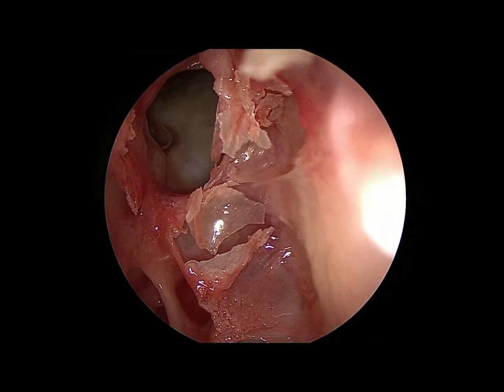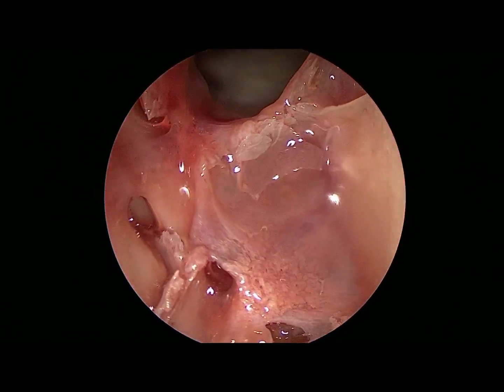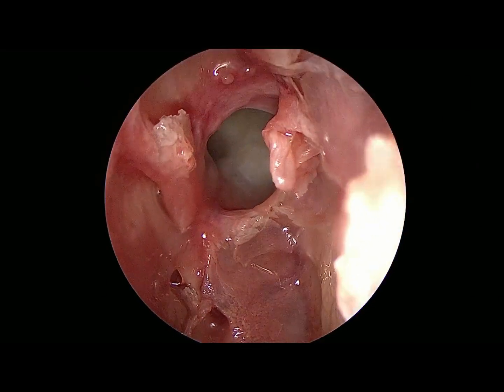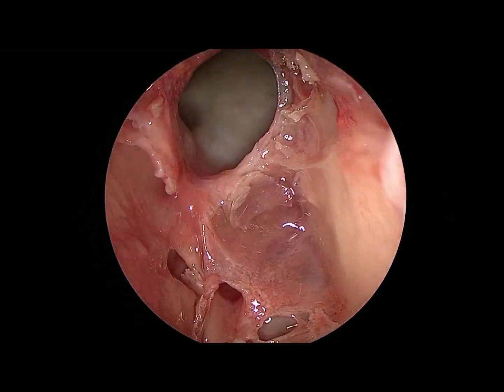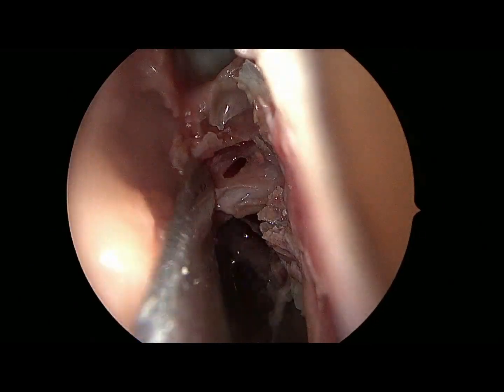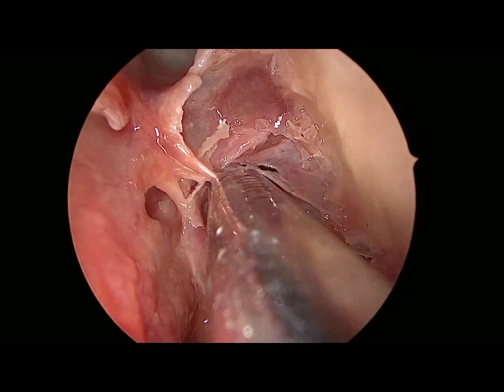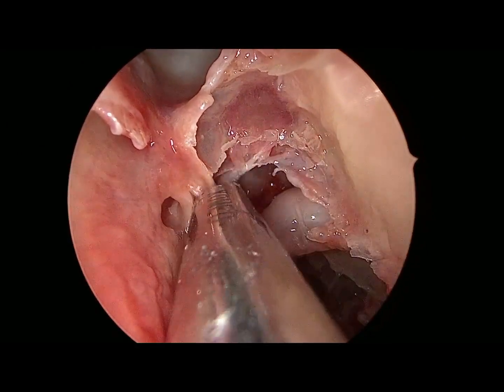Now once the frontal sinus is identified, don't try to traumatize the frontal drainage pathway or frontal recess, which will lead to iatrogenic frontal sinusitis if you do too much meddling in the frontal recess area. Just exposing the frontal recess will be sufficient for a minimal pathology. Unless more pathology is there, don't try to do much dissection in the area.